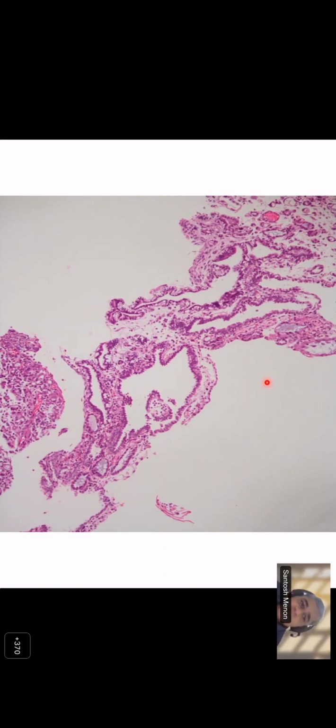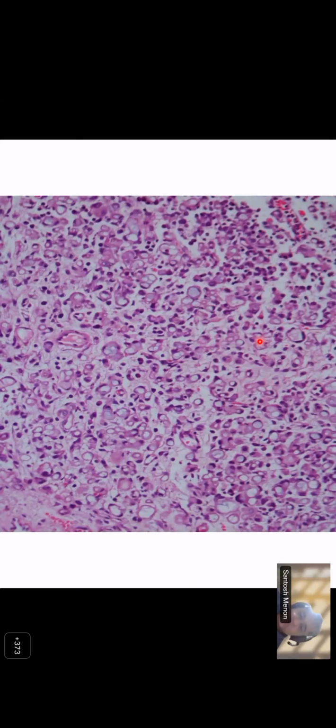So in general, you think that these are bland looking or malignant, benign? So you have seen normal epithelium, normal squamous epithelium. You think it is benign or malignant, you have to give that thought process, very important. Another high power to show you this. So this is almost.